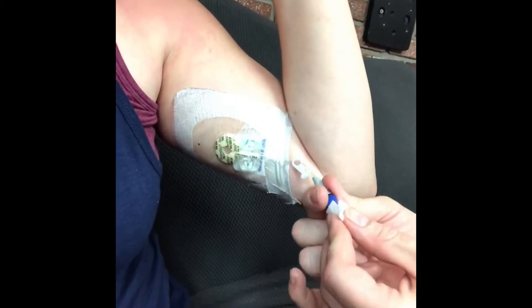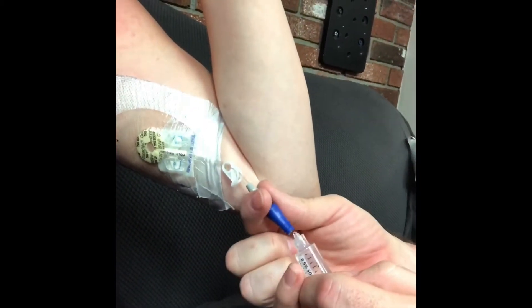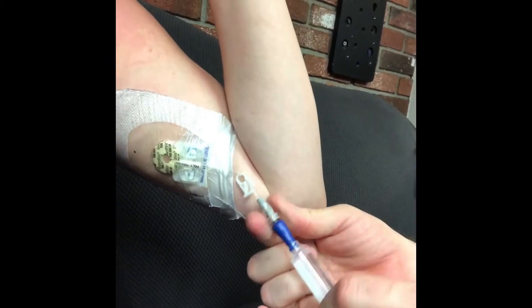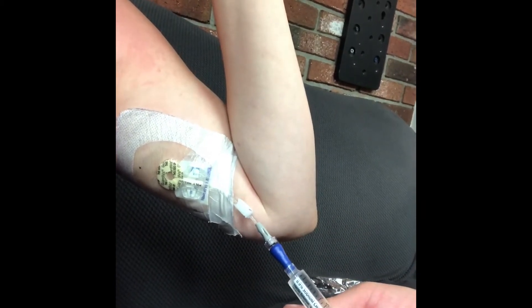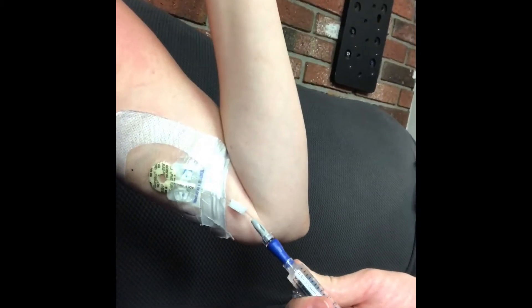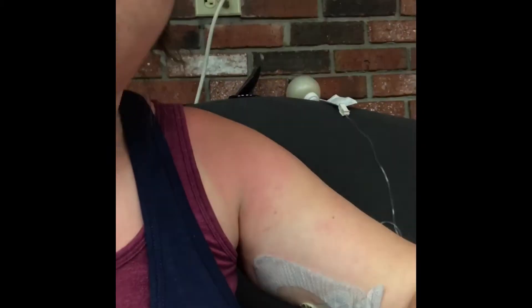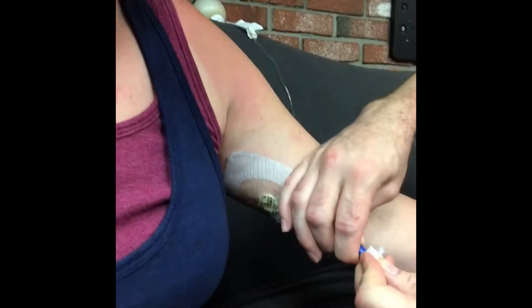Fifteen seconds have passed, and now he makes sure the air bubble is out of the syringe. Then he injects 10 milliliters of saline in a three-pump fashion — it just pushes it in faster. That's the way the nurse said to do it, so that's what he does. I got a little sunburn too. Anyway, back to the wiping.